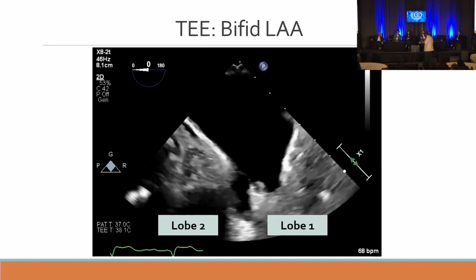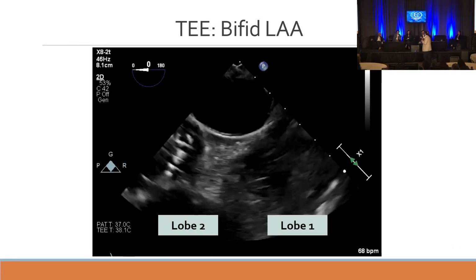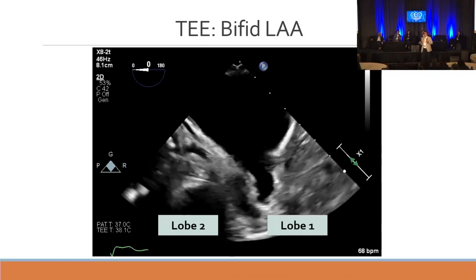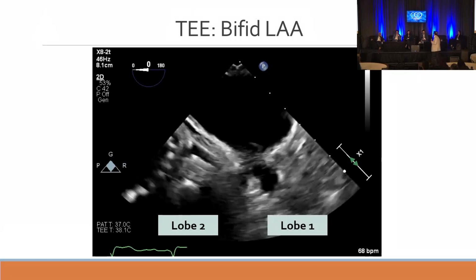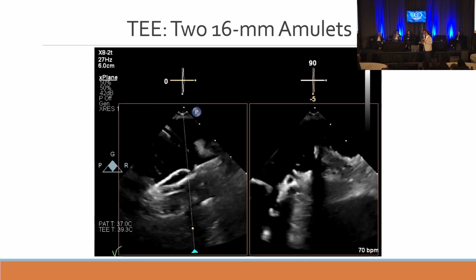With most of our procedures, we do 45, 135. But for the reason that you beautifully showed in the map, we should use those names, which I'll address a little bit later. But essentially, you always look to find the angle that shows you the best representation of anatomy. And here, we're actually doing it at 0 degrees, because now we can really see 2 fancy lobes, lobe 1 and lobe 2. At 0 degrees, lobe 2 is on the left side of the image.